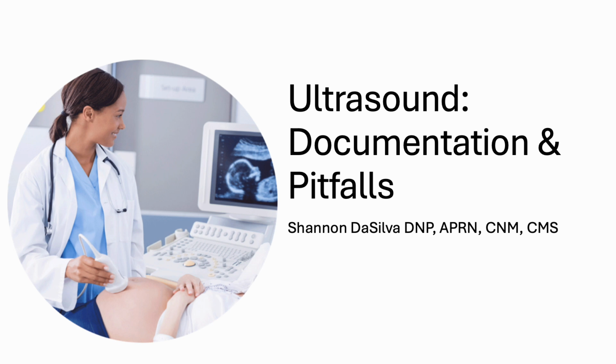In this presentation, we'll talk about ultrasound, documentation, and pitfalls. So this is your pro tips ultrasound presentation.